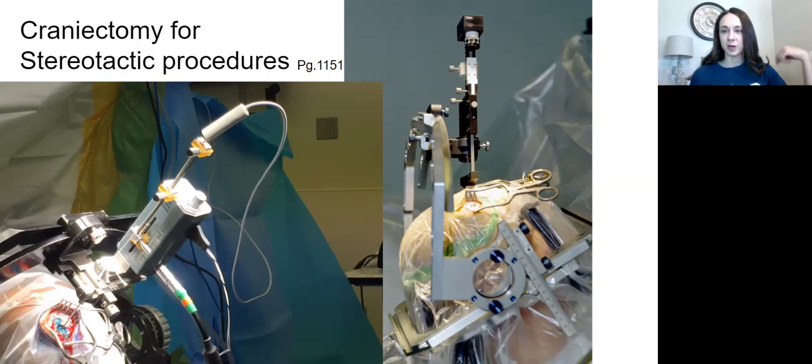So that's what that frame is going to look like. They're going to have 4 pinholes. Same thing. They're going to use lots of lidocaine with epinephrine for these patients. Now these patients are always awake for deep brain stimulators or any stereotactic procedure. So lots of lidocaine, lots of making sure the patient feels comfortable before starting these cases.